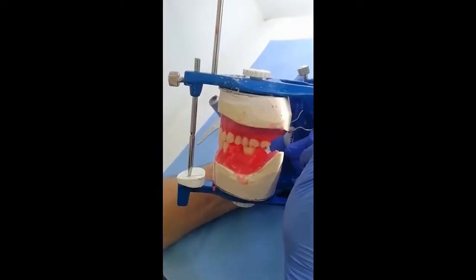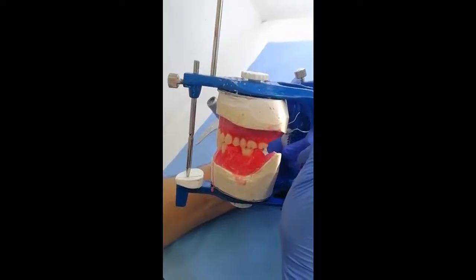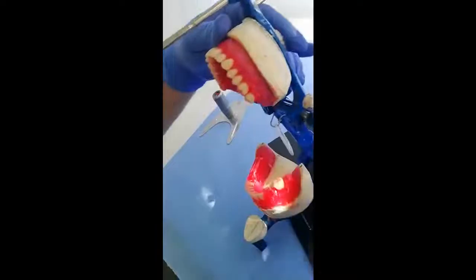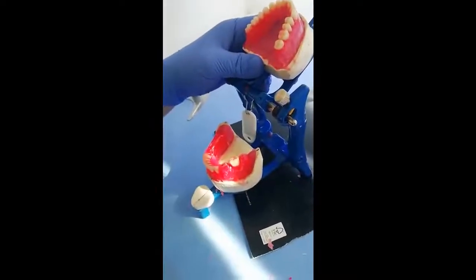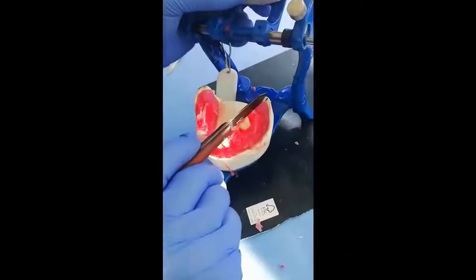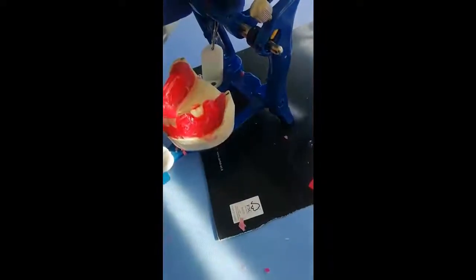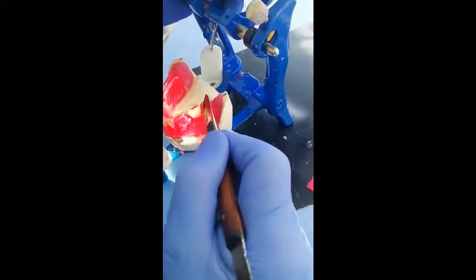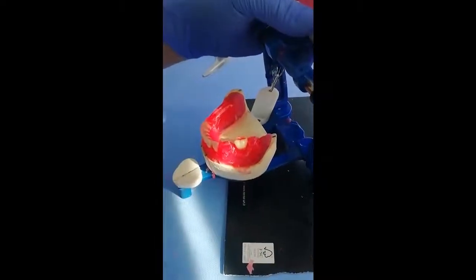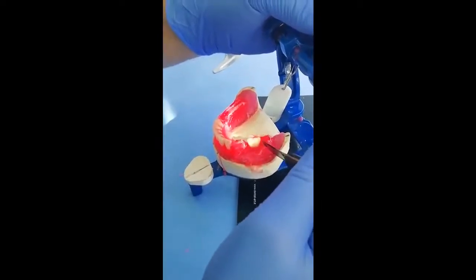This can be easily achieved if we have properly set maxillary teeth with proper anterior posterior compensating curve. Now we proceed for setting the mandibular second molar, and you can notice here the line representing the central crest of the ridge must pass from the central fossa of the mandibular teeth.